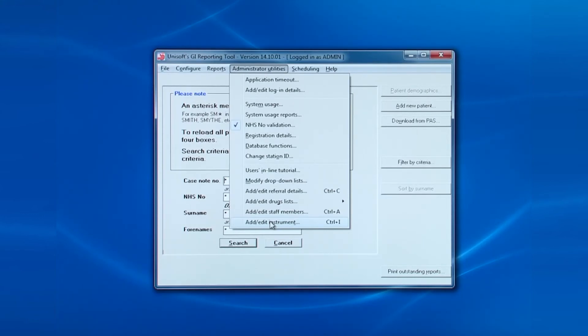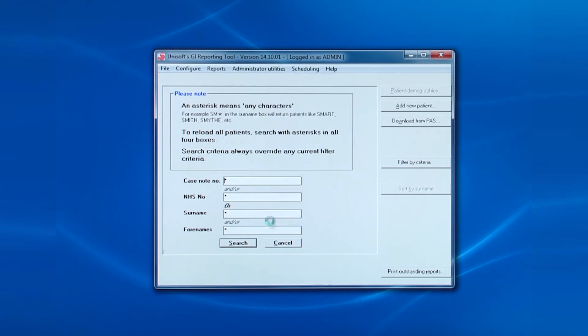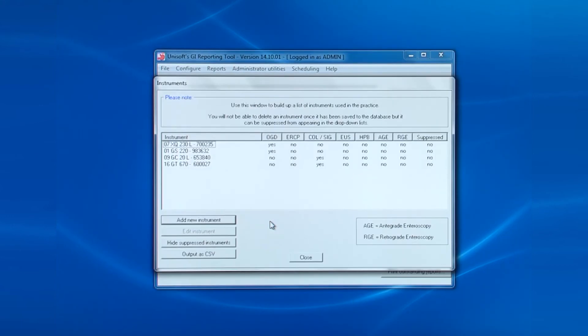Finally, the last item is adding and editing endoscopes. As with the other screens, you can click on the column headings to sort the list into alphabetical order based on the entries in that column.